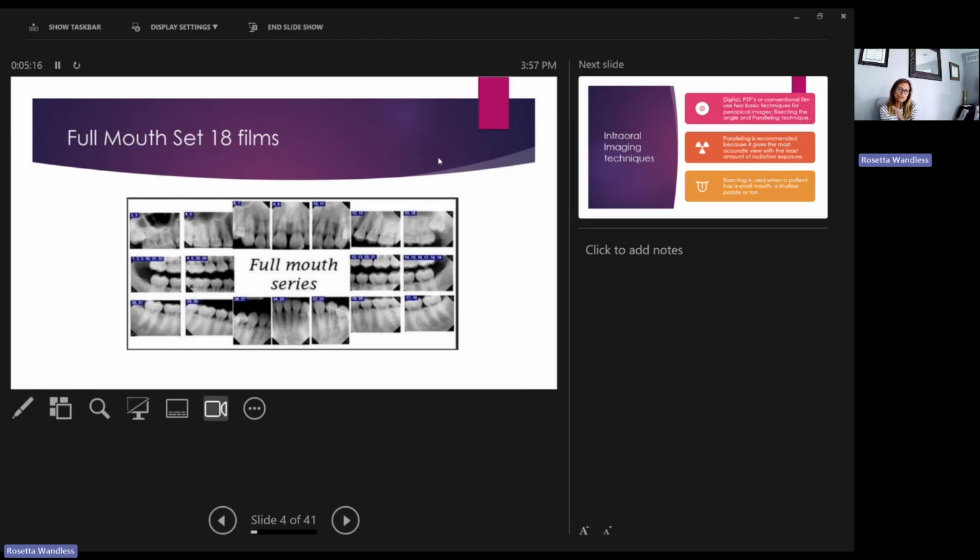So by all means, this is a good gauge or a visual showing that an upper right molar shot is going to have absolutely tooth number 2 and 3 in it, as well as you can see the wisdom tooth here, which is number 1 in this case. So you can say 1, 2, 3.